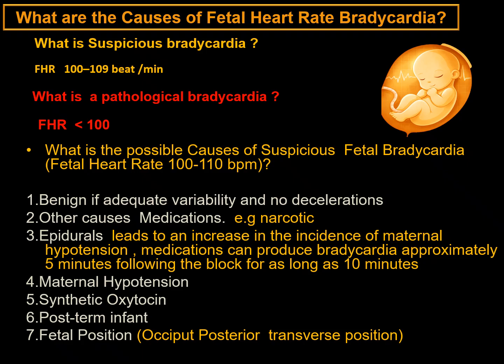There are multiple factors that can affect it and cause suspicious fetal heart rate bradycardia. Benign causes, which you can identify by good variability and no deceleration. Other causes like narcotics; epidural analgesia itself leads to an increase in the incidence of maternal hypotension. Medication can produce bradycardia approximately 5 minutes following the block for as long as 10 minutes. Also maternal hypotension, oxytocin use, post-term infant per se, and fetal position like occipito-posterior and deep transverse arrest.